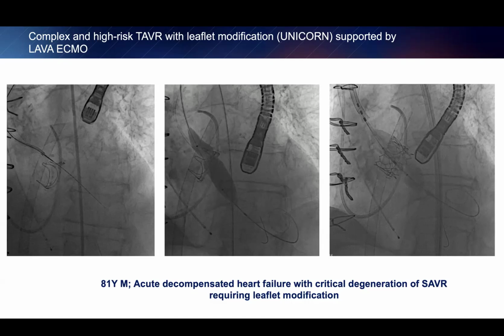To be completely fair, the data on RP Impella is not good, and unless it happens very acutely, I don't think it provides enough support for acute and chronic RV failure. So what I think we should do is get heart failure involved early on. Some providers are more aggressive than others, but I think we should get heart failure involved right away. And if we agree that this is acute and chronic RV dysfunction, talk to the surgeons about a Protek Duo.